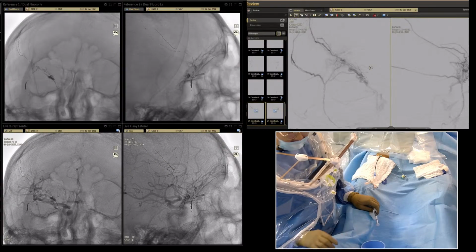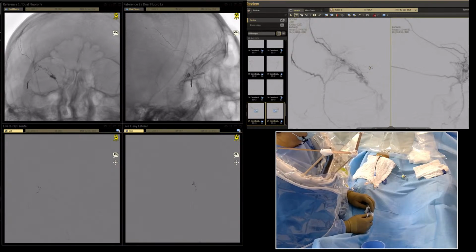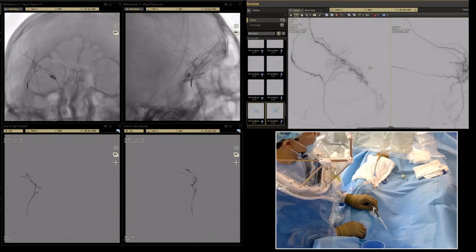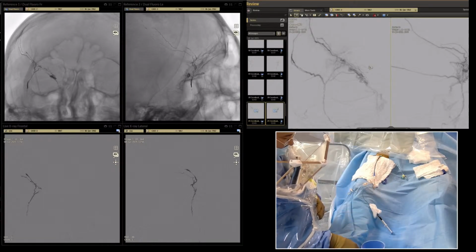Okay. We don't need to go down till this cast of the liquid embolic. And now the liquid embolic will go from the second branch. It's refluxing, it's okay. But it's not going to the smaller branches. Okay. Okay, let's wait a little bit. We have time.